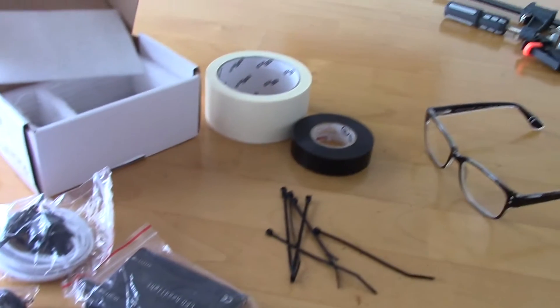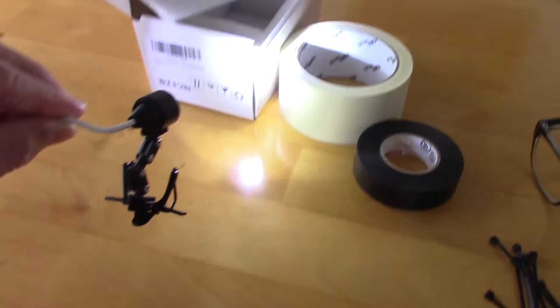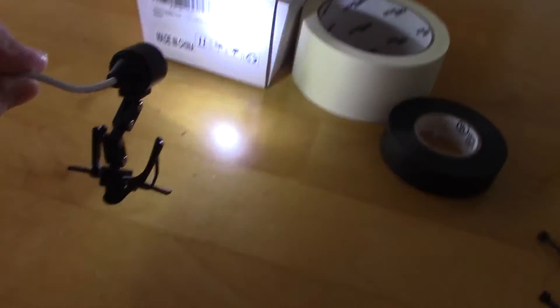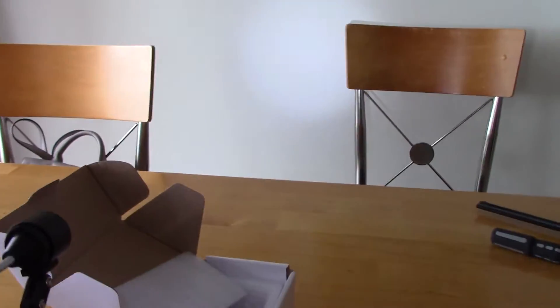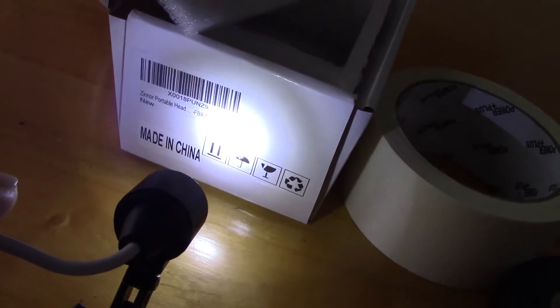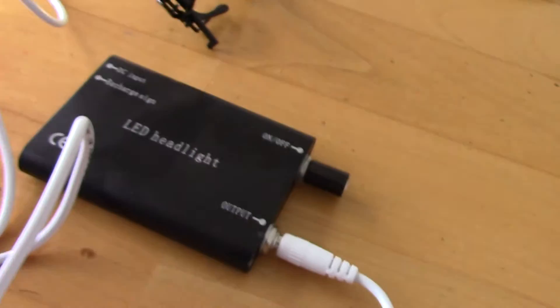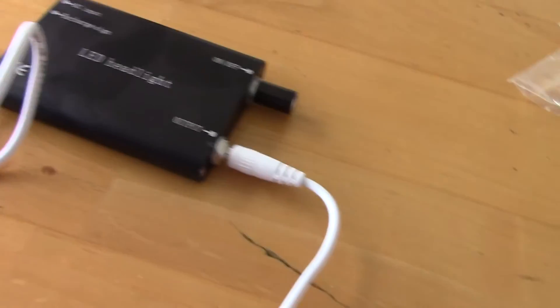Very bright — I'll show you. Here's the light turned on; it's extremely bright. That's about six feet away on the wall. It has variable power.